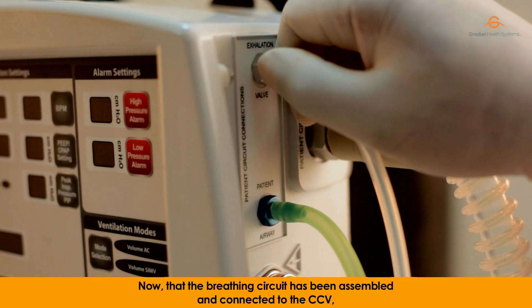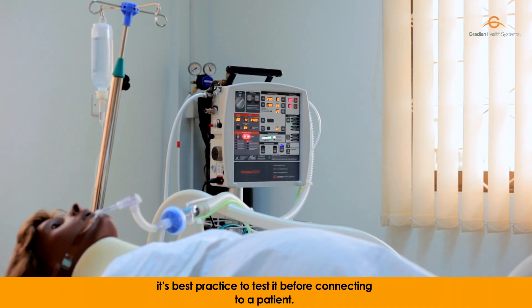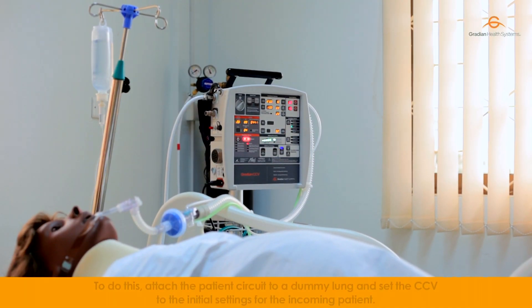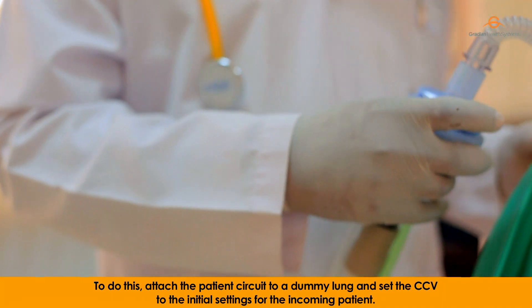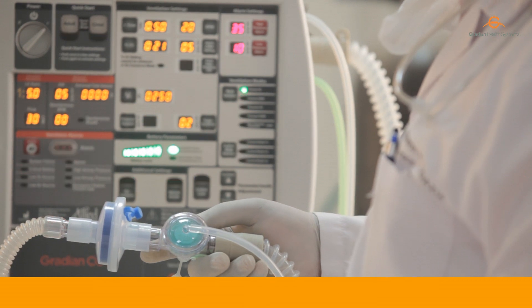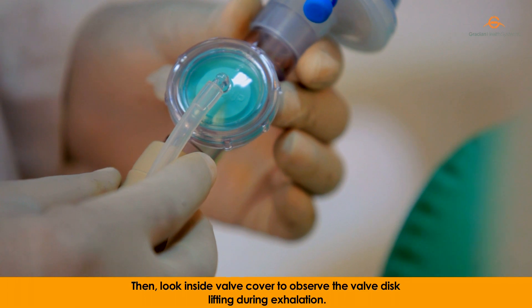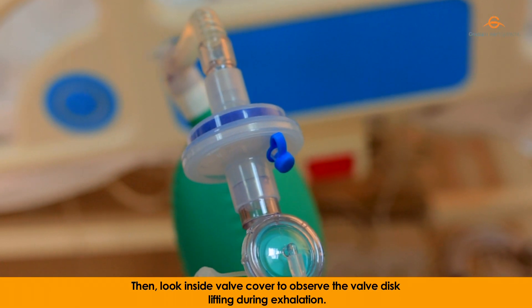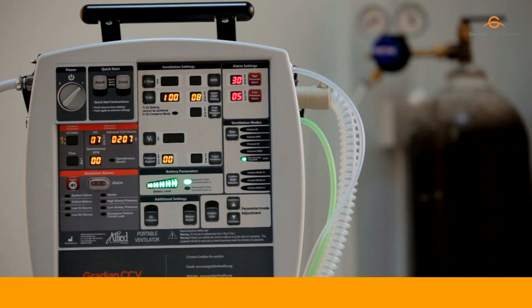Now that the breathing circuit has been assembled and connected to the CCV, it's best practice to test it before connecting to a patient. To do this, attach the patient circuit to a dummy lung and set the CCV to the initial settings for the incoming patient. Allow the ventilator to run and stabilize. Then, look inside the valve cover to observe the valve disc lifting during exhalation. Lastly, allow the CCV to run for at least 20 seconds to make sure it does not trigger a low airway pressure alarm or excessive patient circuit leak alarm.